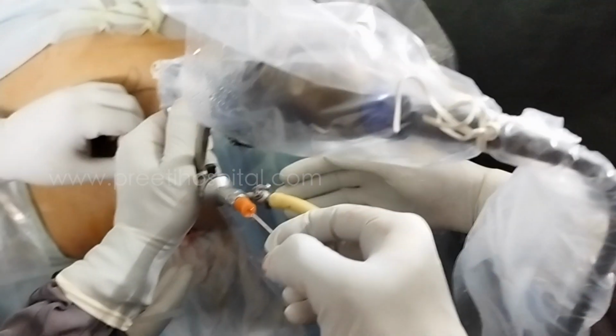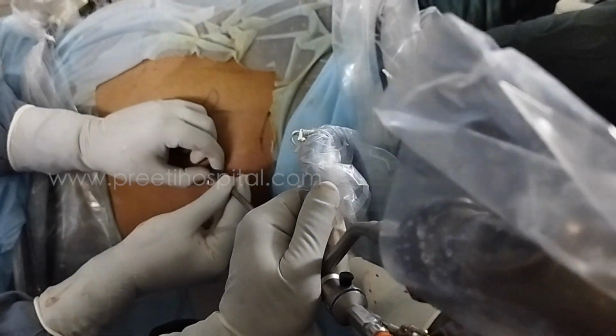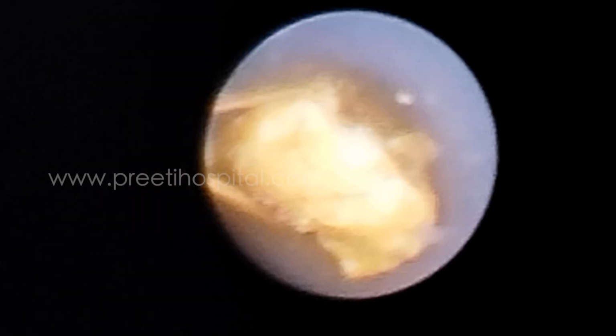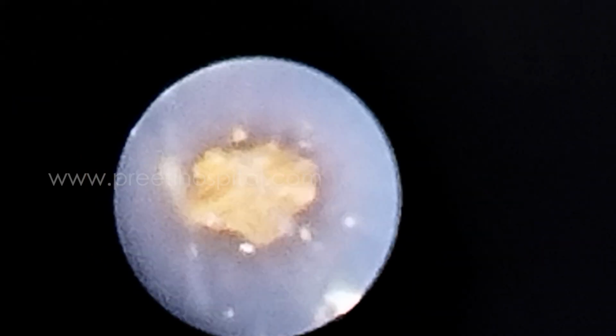Yes, sir. Here, actually, I am slightly more medial puncture. If you do more medial puncture, your working space will be limited. So it's not an ideal puncture, but we got away. No, you could not inject the contrast into the lower calyx. Let us see where we can improve. Every case you should analyze where you can improve.